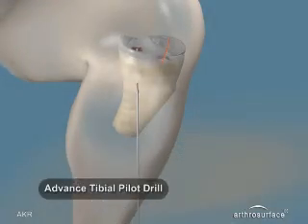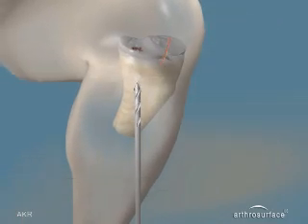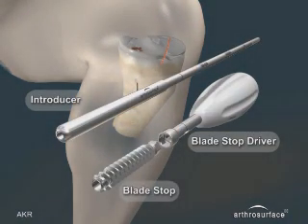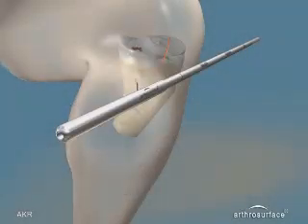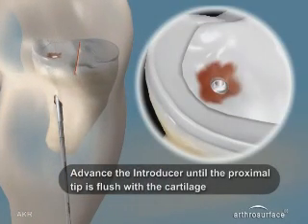Advance the tibial pilot drill over the guide wire and through the tibial plateau. Be sure to avoid reaming into the femoral condyle and remove the hardware. Advance the introducer until the proximal tip of the introducer is flush with the cartilage.